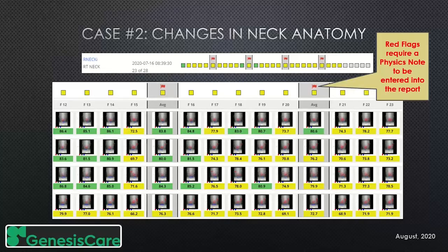And when you restore the patient, everything is calculated a second time, so you see the red flags. If I were to click on these red flags and respond, I would get duplicate records for this particular patient. So that's the reason I chose not to do that. So once you click on it and respond to it, then they turn gray.